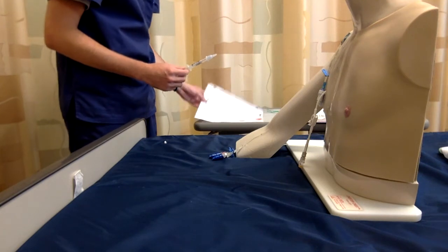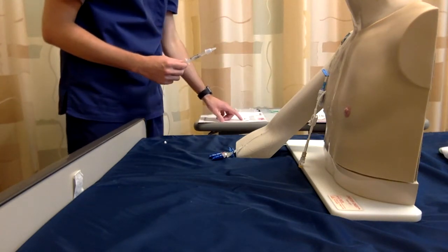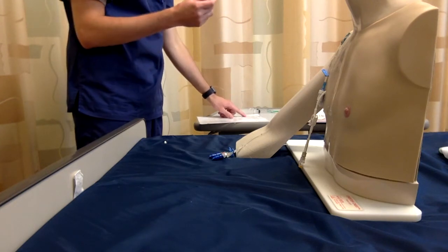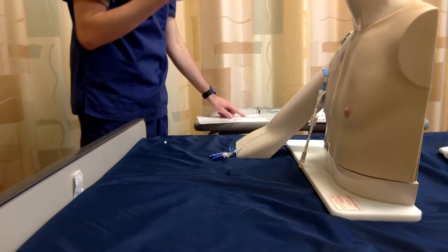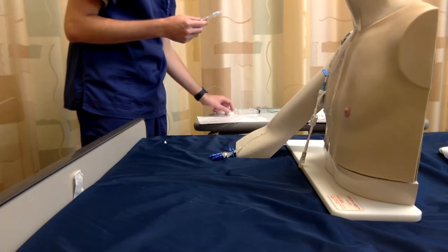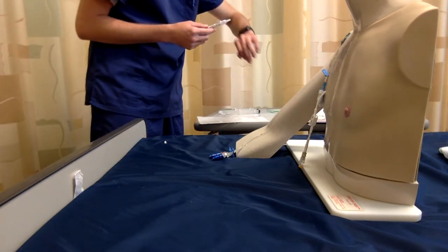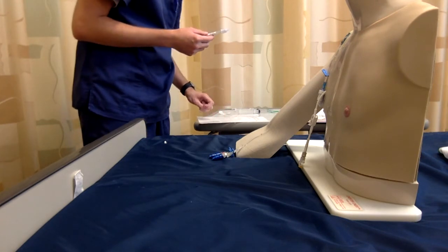So we have Bob Owens, 922.33, getting Lorazepam 1 milligram IV to push over 2 to 5 minutes at 12:20.